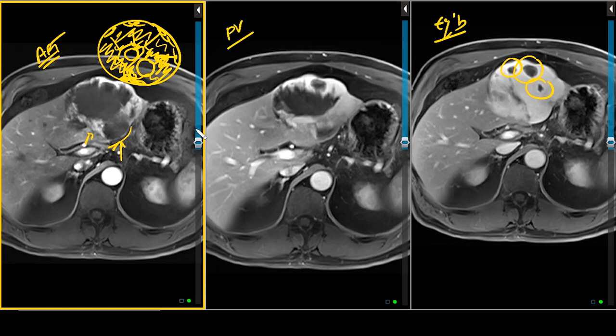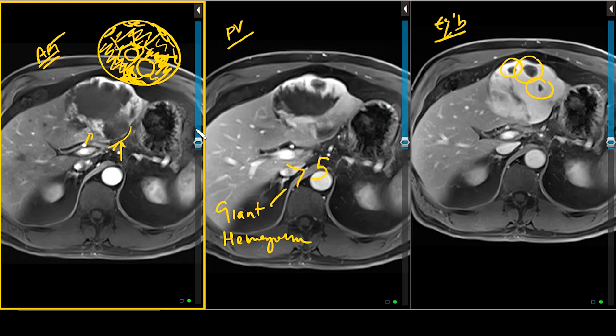This lesion is compatible with a giant hemangioma. The definition of giant hemangioma differs in the literature — some say more than 4 centimeters, some say 6 centimeters, and I've read 10 centimeters — but generally, if it's more than 5 centimeters, it qualifies as a giant hemangioma.